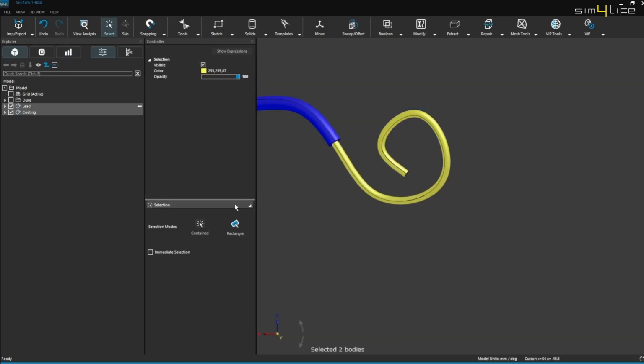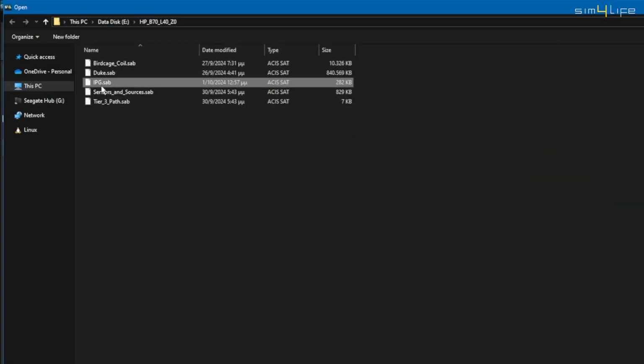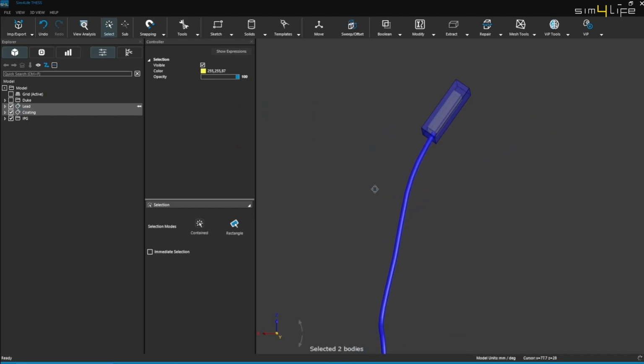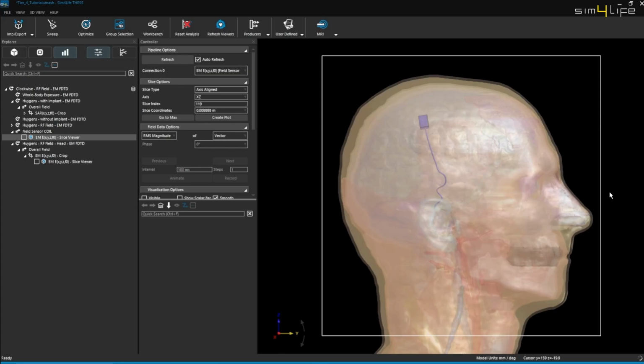Additionally, we position a model of the implantable pulse generator, IPG, which is part of our study of active implantable medical devices. The IPG is placed at the end of the lead, positioned tangentially to Duke's skull.